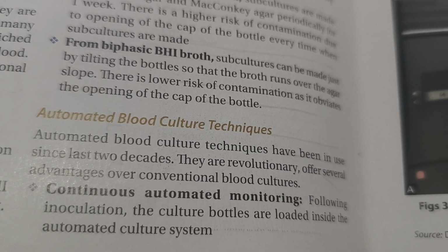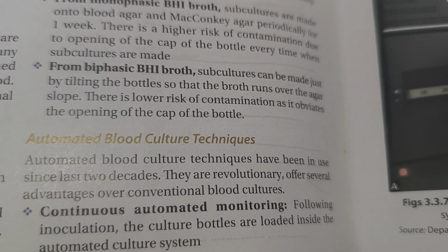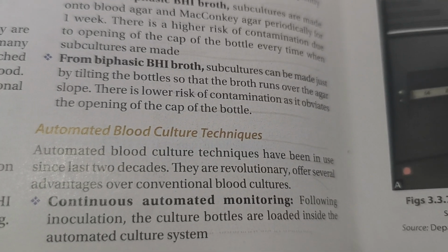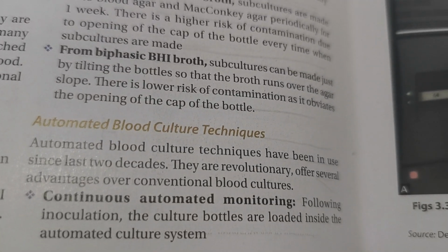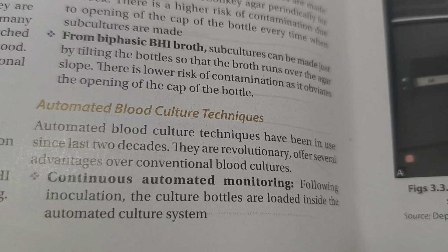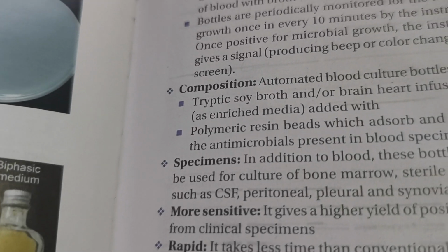Automated blood culture. Automated blood culture techniques have been in use since last 2 decades. They are revolutionary, offer several advantages over conventional blood cultures. Continuous automated monitoring. Following inoculation, the culture bottles are loaded inside the automated culture system.